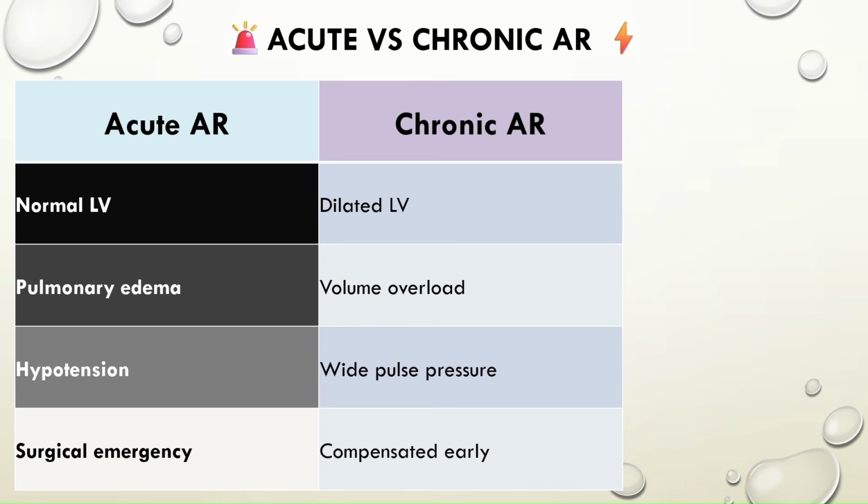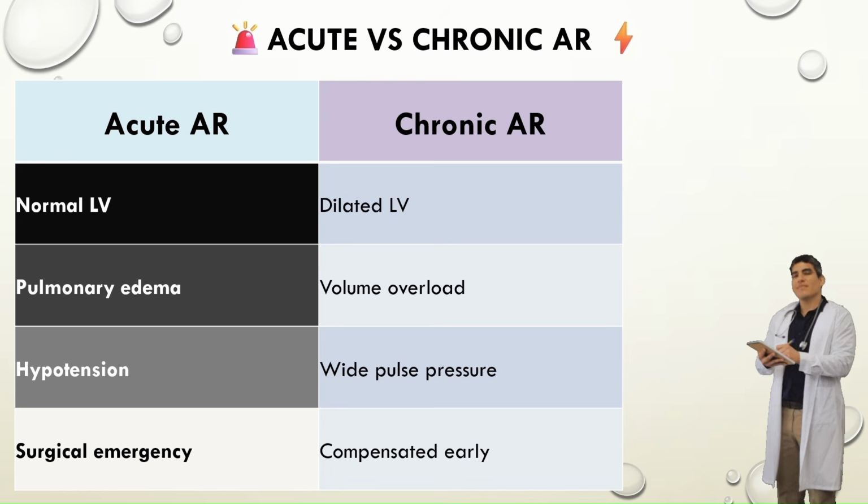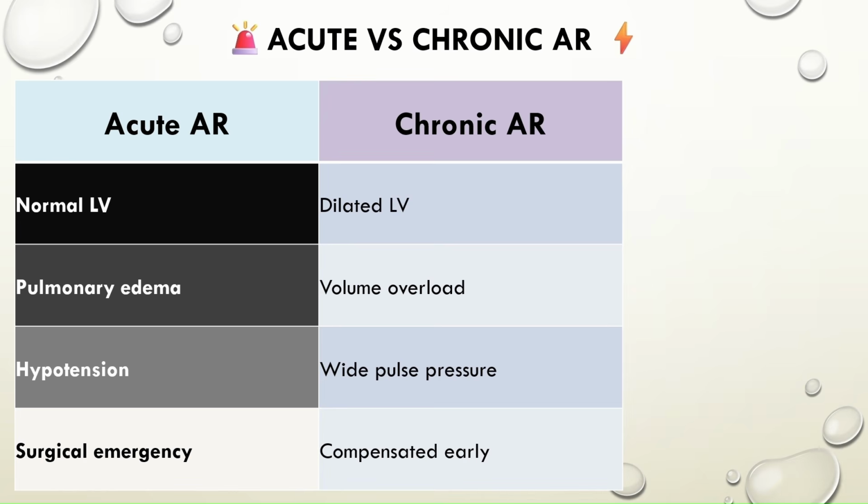Feel free to pause the screen or take a screenshot of this slide. This acute versus chronic comparison is very important to both clinical practice and the registry.